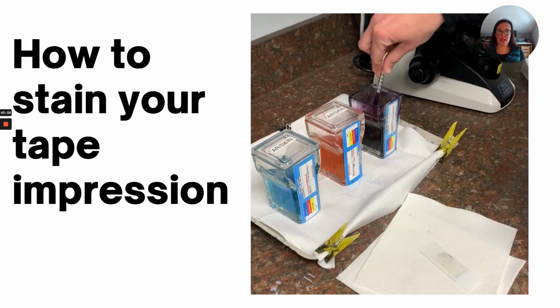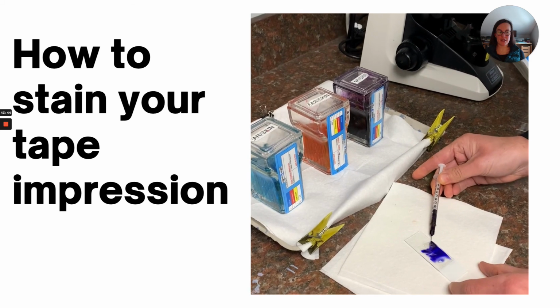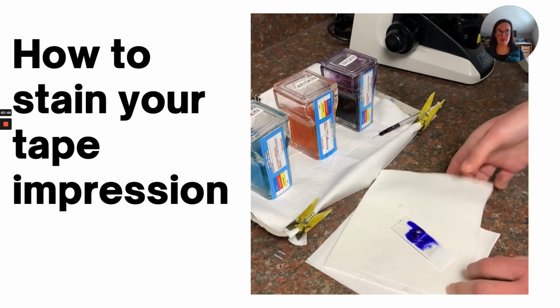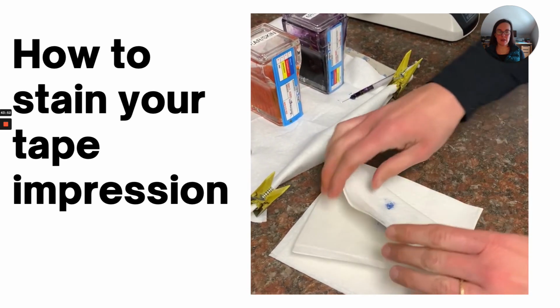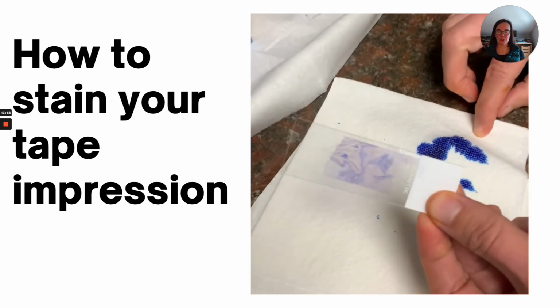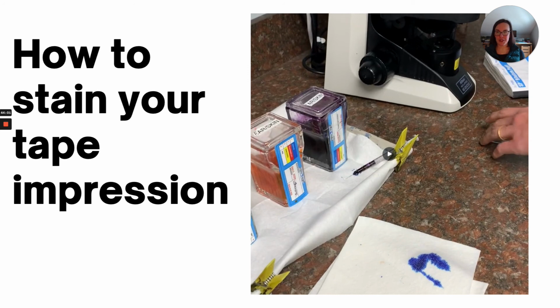And when I'm staining my impressions, I get a syringe filled with methylene blue. I place the needle under the stain and I flood the area. Take a paper towel, the thicker the better, else you'll get your fingers stained, and I press, and then bada bing, your slide is stained. So never do fixative on a tape. It'll just take off the tape. And then you're not going to get any value from using eosin. So really what we care about is staining cellular components with our basophilic stain, and that is going to be best accomplished with the methylene blue.